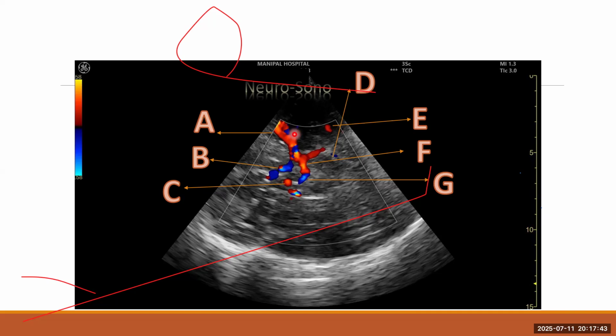So there can occasionally be red Doppler signals coming towards the probe on the transtemporal window, but it is much more posterior, or let's say at right angles to the MCA. These are typically the posterior choroidal vessels, which are branches of the PCAs. So we need to remember this, and we shouldn't confuse it with the MCA when we insonate. Hence the pointer direction and identification of landmarks, because this is MCA, running along the sphenoid edge, which goes into the Sylvian fissure.